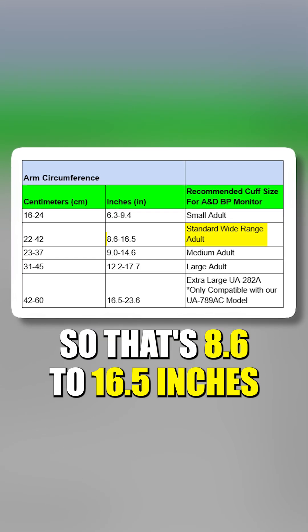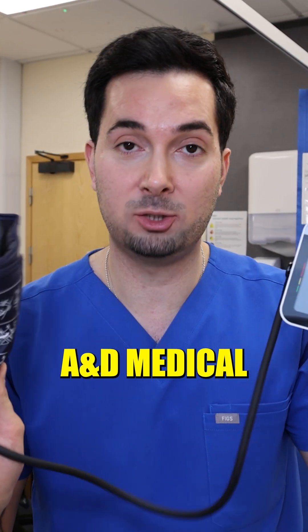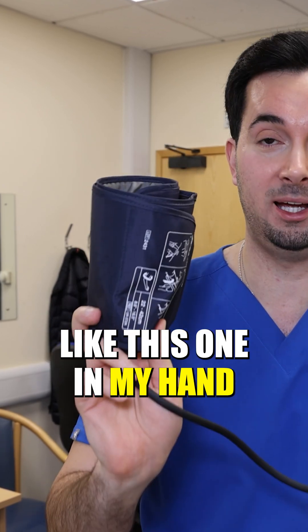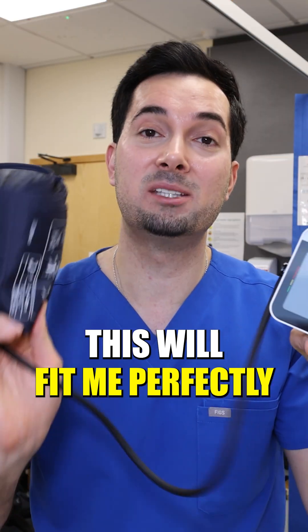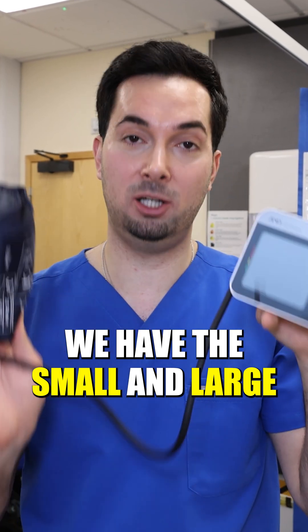So my arm circumference was 12 and a half inches. My arm will fit the standard wide range adult cuff, which is 8.6 to 16.5 inches. The good news is that most of our A&D Medical blood pressure monitors come with the standard wide range cuff, like this one in my hand, so given my measurements this will fit me perfectly.